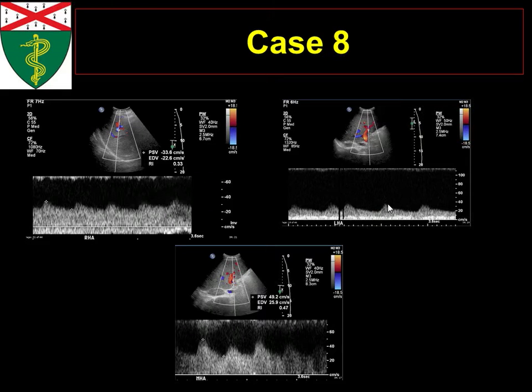And what about the peak systolic velocity itself? It's dampened. It's relatively dampened. And so what you end up getting a lot of times as a result of that, in these tardus parvus waveforms, you end up getting resistive indices that are lower as well. That's 0.3. So I've interrogated the patient's right hepatic artery, the left hepatic artery, tardus parvus waveform. So what does that tell me? Oh, Stephen knows this. What's going on? There's a stenosis.